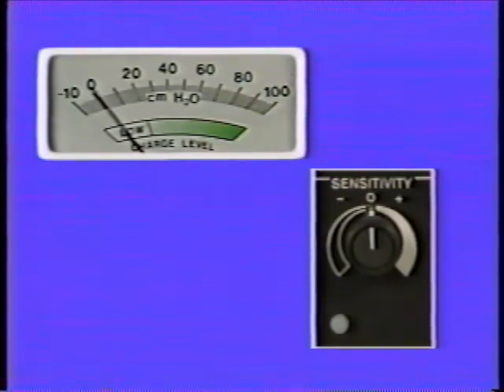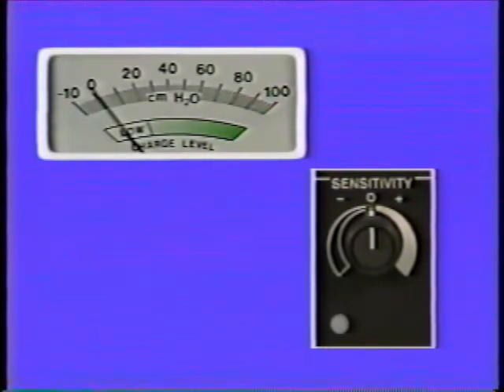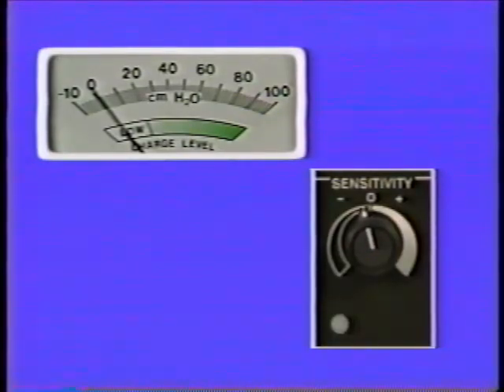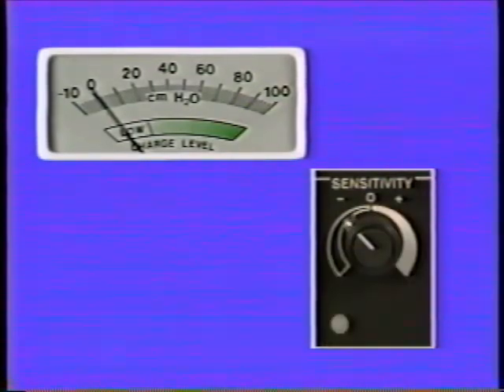The sensitivity control may be set between the levels of -10 and +10 centimeters of water. Set the sensitivity control slightly to the left of its 0 position. Observe the airway pressure gauge to determine how much patient effort is required to activate the sensitivity indicator. However, if the sensitivity control is set too far to the left, additional patient effort will be required.